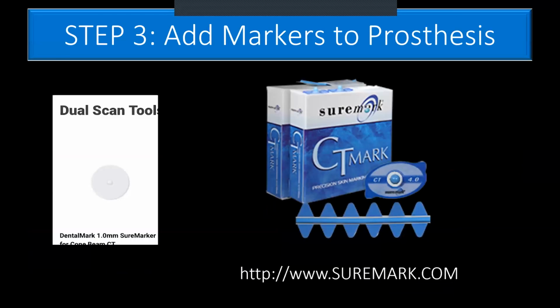We're then going to add these little markers, or they're called fiduciary markers, to the patient's prosthesis. So you can get them anywhere online. You can actually just get them on Amazon. I ordered them a couple of weeks ago on Amazon, but they're a little sticker that will stick to the denture, and in the middle is a radiopaque bead. So when we're taking our CBCT, we're going to get that little bead that's going to show up very clearly on the CBCT.